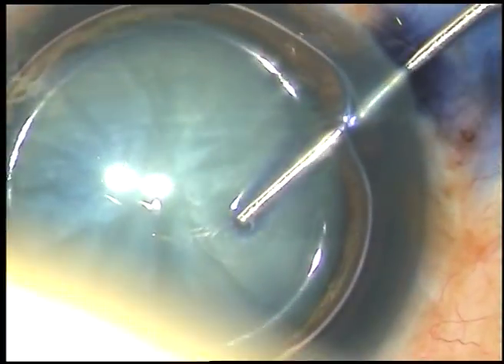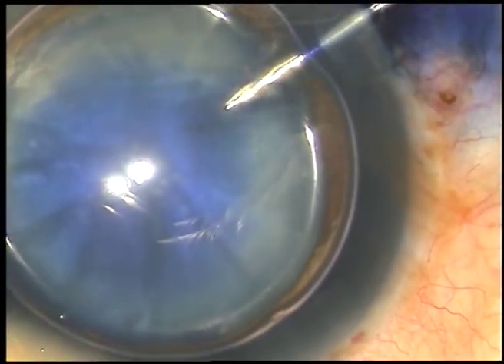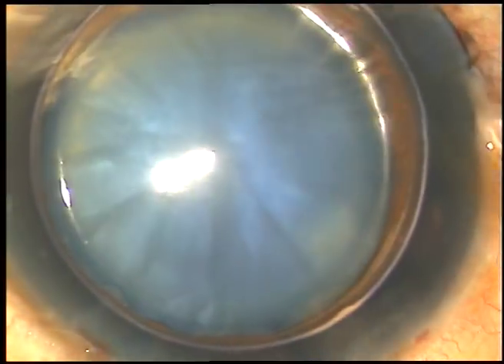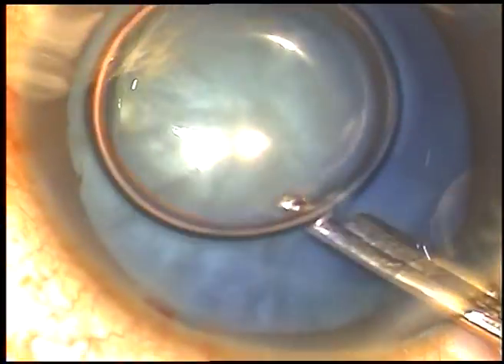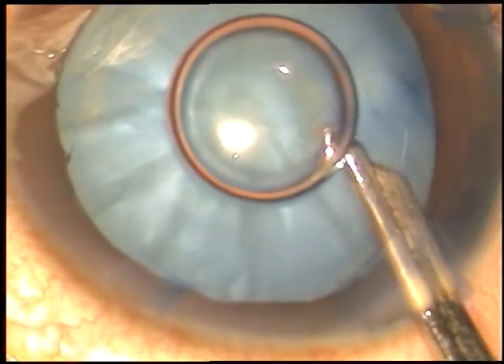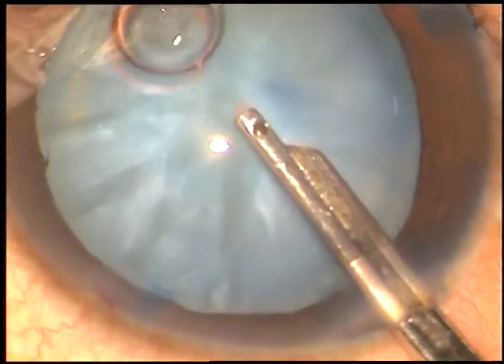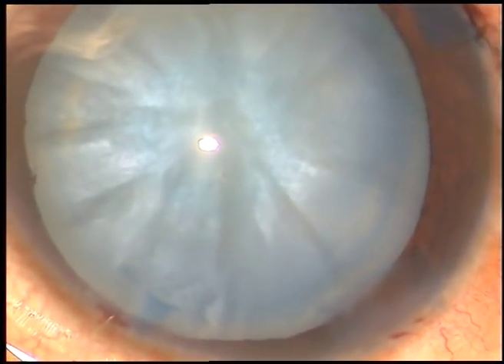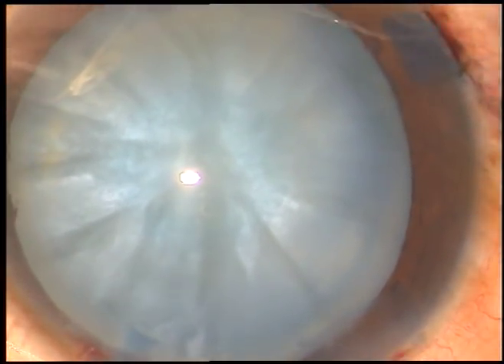This dye will stain the anterior capsule nicely and it will facilitate capsulorhexis. The dye is washed out after five, six seconds. And now, in this case, I am going to use viscoat plus HPMC.